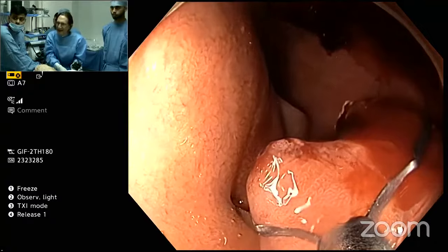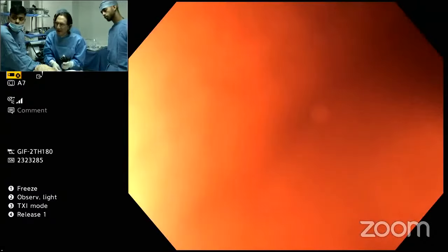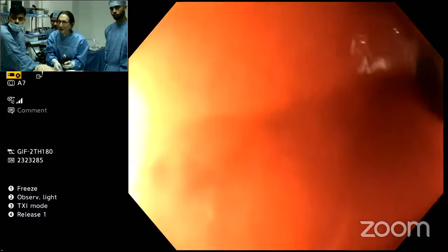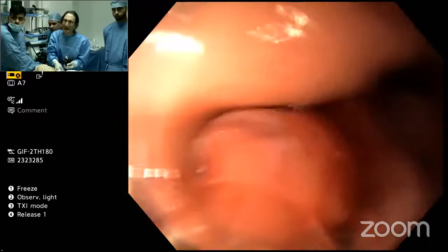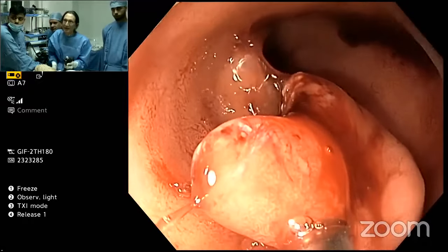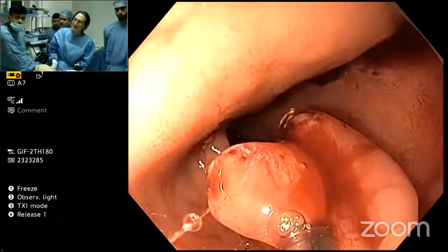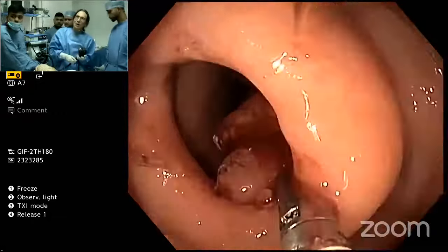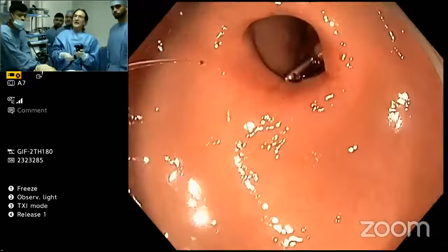My assistant is my hero. Okay, and suck in, it'll close. Just close it now. I sucked it in. Close. Did you close? Okay, just hold it there. Close. Don't deploy yet. I want to look and see whether I actually got it. Oh, it looks great. Deploy. Yeah, deploy. Good. All right. See, everything is harder. Even the clip is hard to come off, and there it came off.